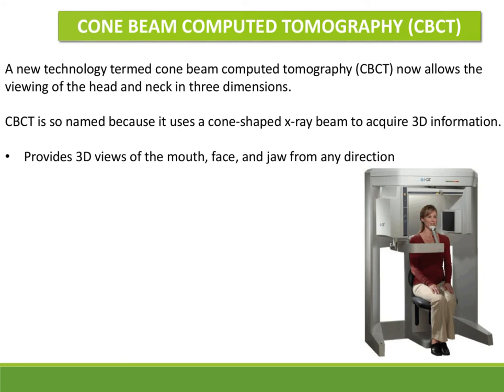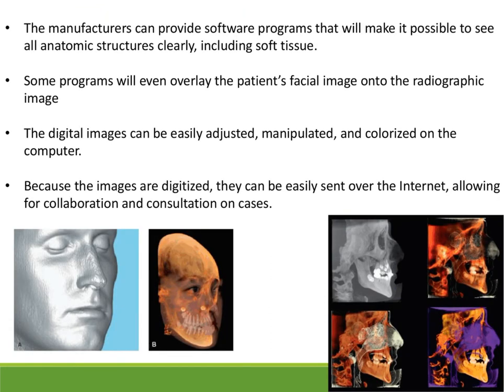Cone beam CT is a new technology in which you take 3D imaging rather than the 2D that you have been practicing so far. Okay, 2D intraoral, 2D extraoral. We get only the length and the breadth. If you want the depth, you have to go in for 3D imaging.